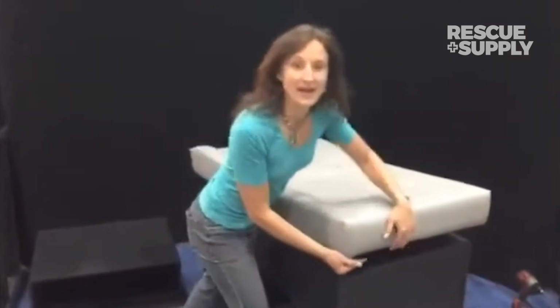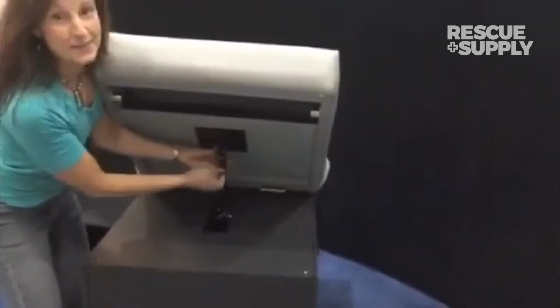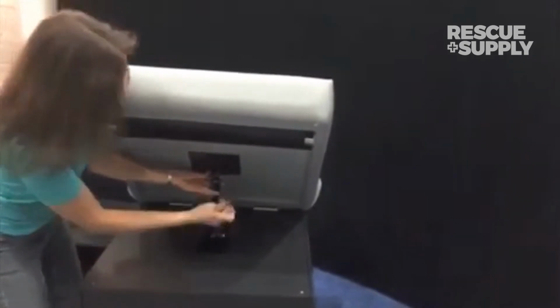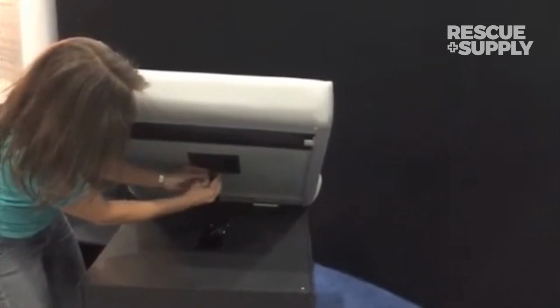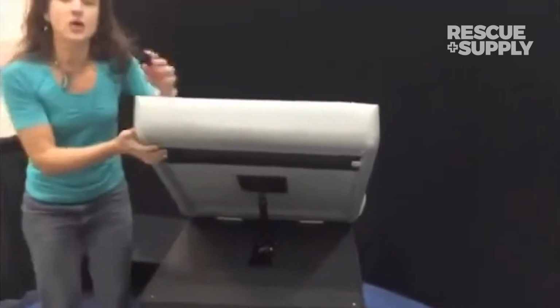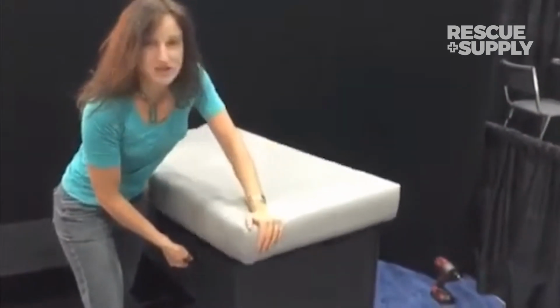Now we're going to lift the back of the cushion and install the lift mechanism arm into the bracket at the back of the cushion using the bolt and nut that you received in your hardware kit. To lower the cushion, you'll just release the handle and push the cushion down.